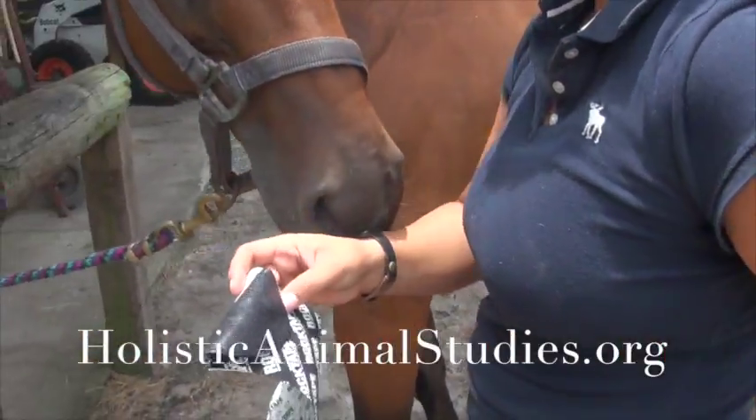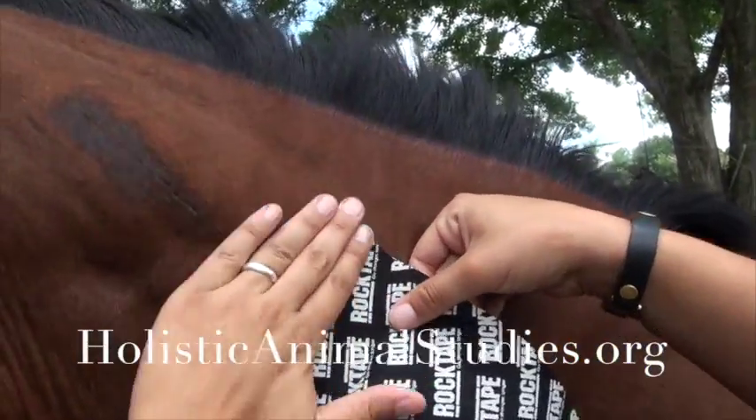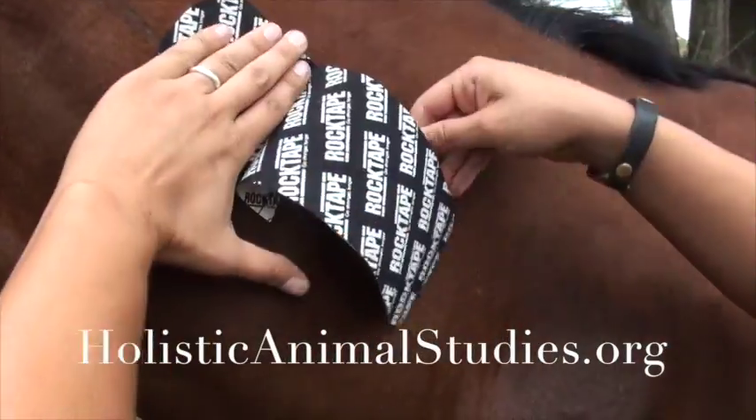I'm going to take the base and place it down on Shea's neck where I want it. We're going to put it right here because that's where her pain was. And I'm going to rub it down good just to make sure it's stuck to her well.